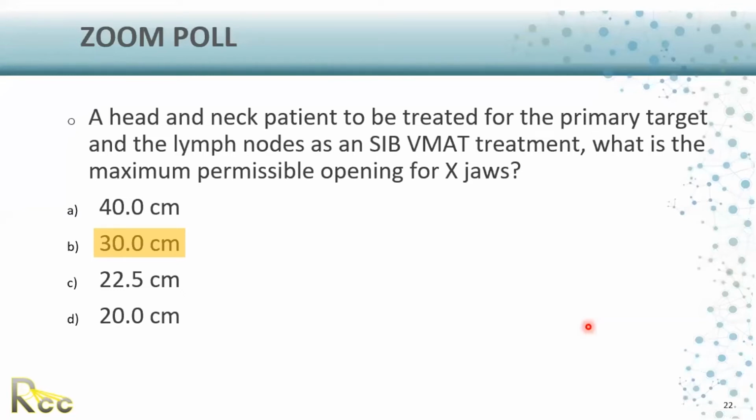What about the machine calibration? What about the ion chamber you have been using? What about the software itself that you are using? What about the patient setup? There are a lot of errors that could accumulate, and then you will exceed the permissible 5% for your dose discrepancy. Other centers, as I said, include it with the body.